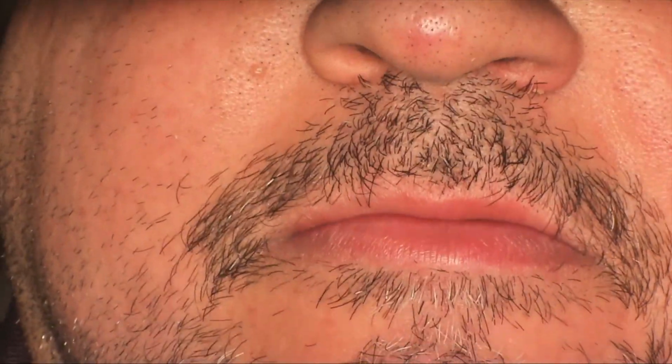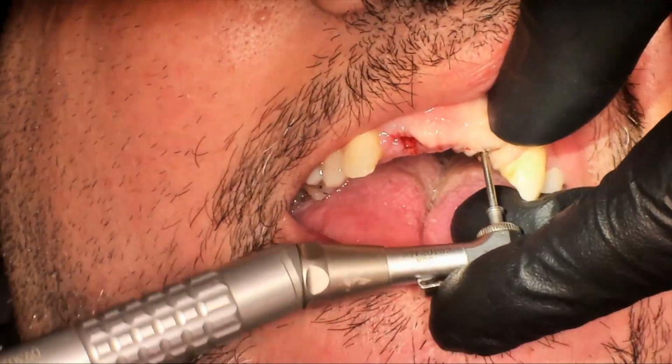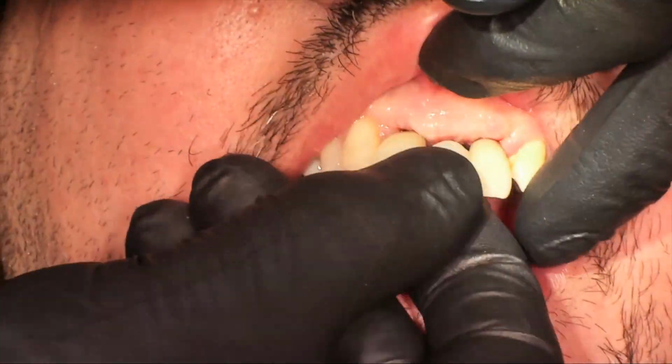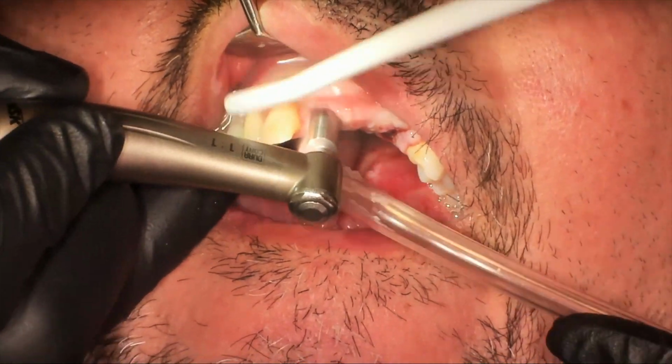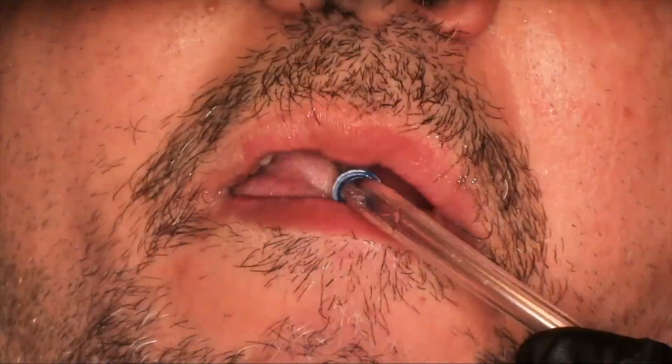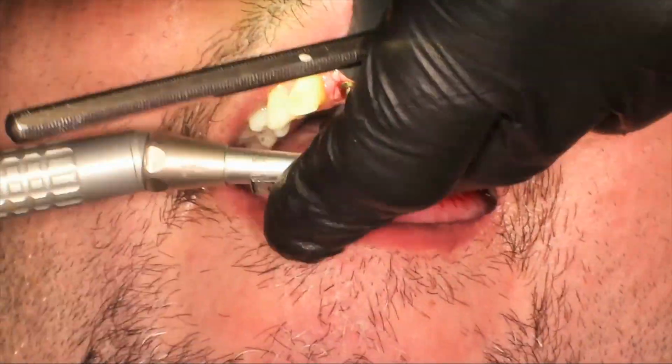And now the real work here is going to be delivering the temporary bridge here in the front. We have 2 implants, site number 7 and site number 9. These were placed by a local periodontist, and we're restoring our patient here. Here we're trying in the bridge, and we're seeing excess pressure on the Pontic area of number 9, and that's pretty much what we expected and asked for. We want to build an ovate site. So here we're putting the healing abutments back on, and we're going to use a tissue punch to enlarge the site around the implants themselves.